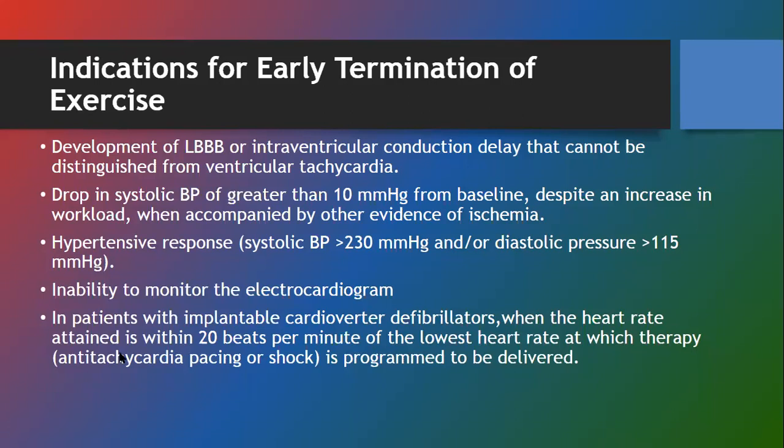Also stop when the heart rate attained is within 20 beats per minute of the lowest heart rate at which therapy is programmed to be delivered. This means if anti-tachycardia pacing or shock is programmed to deliver at 150 and the heart rate is going to achieve that, then you have to stop the test to prevent the shock.